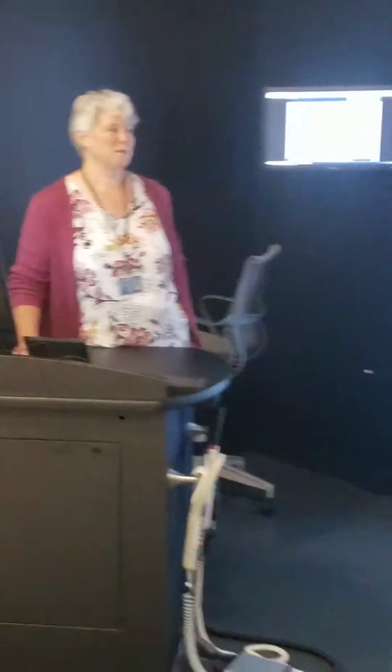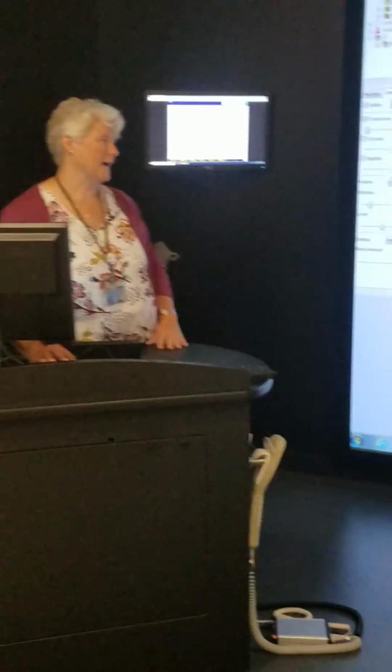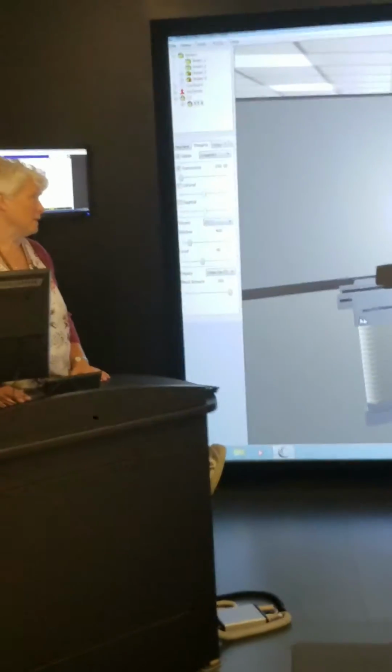Radiation Therapy Program Director here at VCU, and I want to show you our new classroom and talk to you a little bit about what a radiation therapist does on a day-to-day basis. So this newest piece of equipment we have is called Vert, short for virtual. So we are virtually looking at what a radiation therapy machine looks like and all of its capabilities.